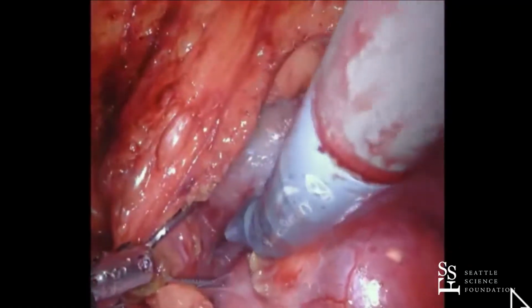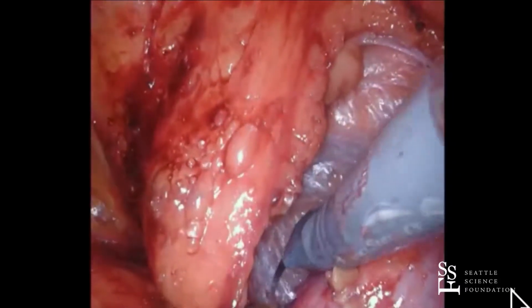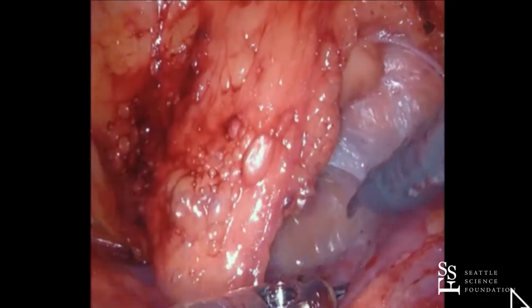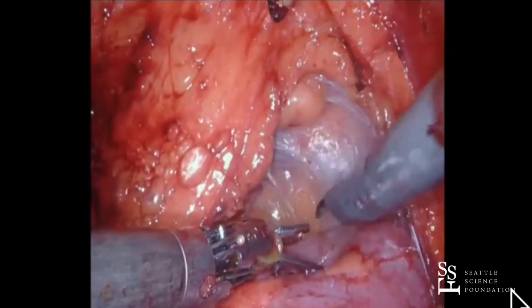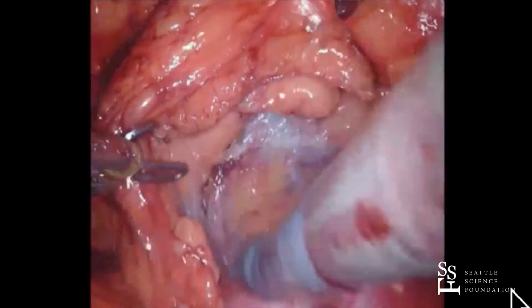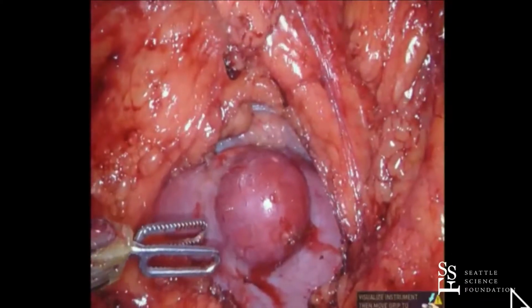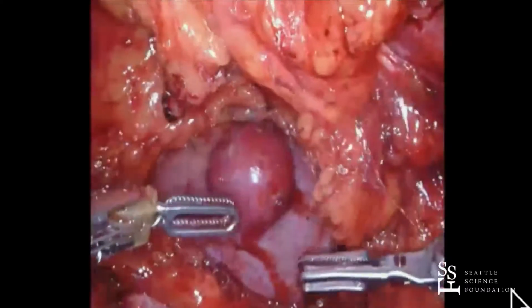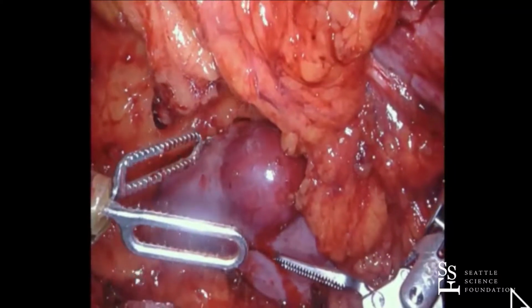I think that's a good point, and this applies equally to transperitoneal and retroperitoneal. When you are ready to cut your tumor out, you want that tumor in the ideal location so that you can see every surface of it. You don't want to cut corners and just say, I see the tumor, I'll cut it out and start sewing. If you can't see the far edge and you cut the tumor out, you're not going to be able to see where you need to sew. That extra step Jim just did, rotating the kidney to see the far side better, is going to make it much easier for him when he cuts this out and sews it back together. Go ahead.